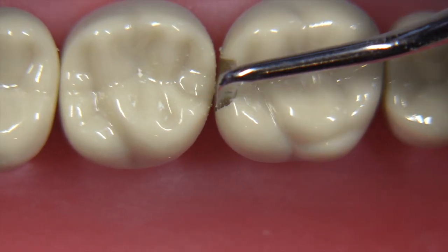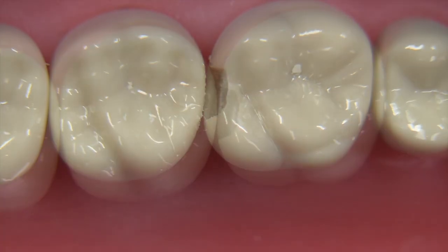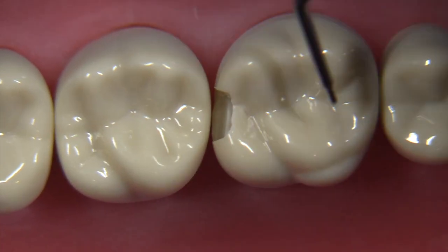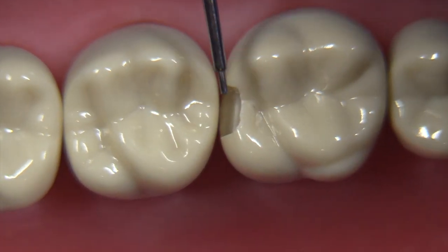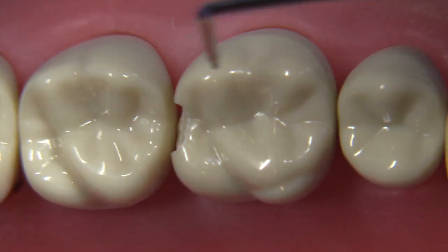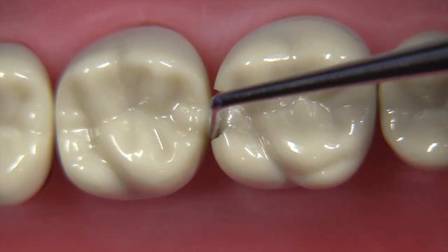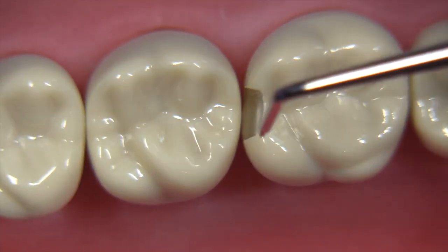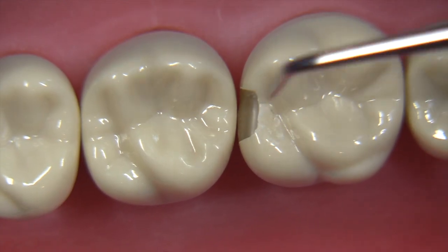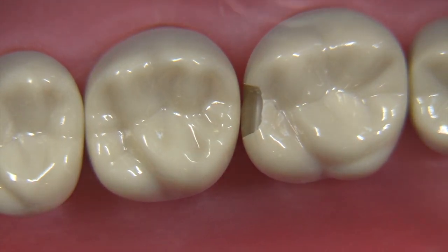It's also critical that the axial depth - in other words the direction towards the pulp - is deep enough to allow the instrument to be used. You can always check with the RGS and see how your extensions are going. You can see the gingival is under-extended, so we need to extend that a little bit further.